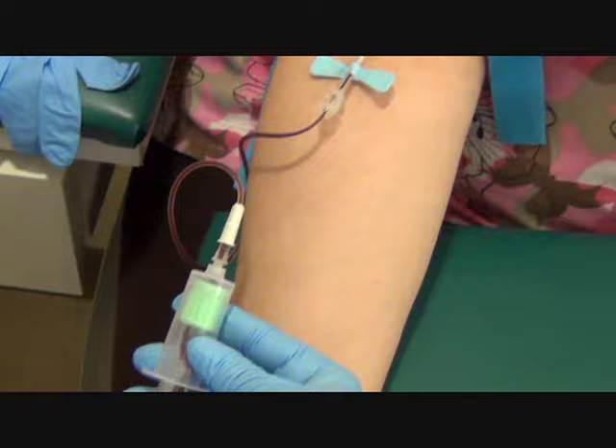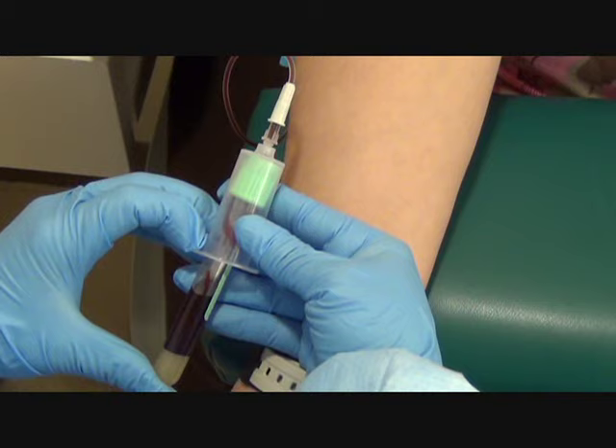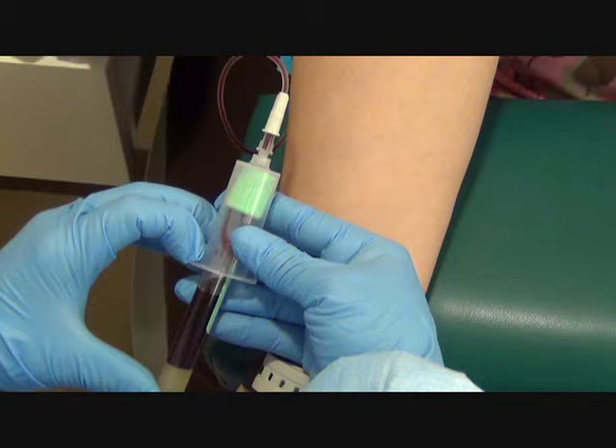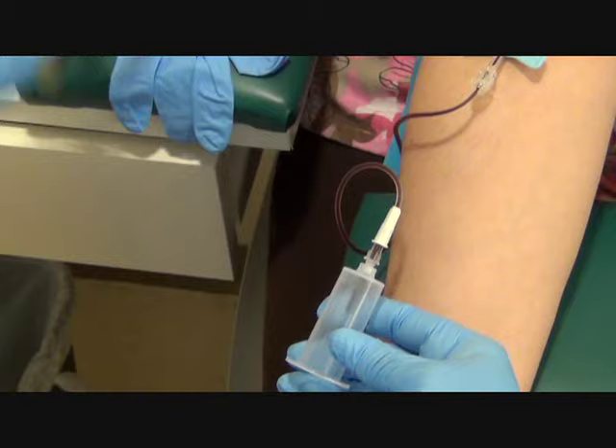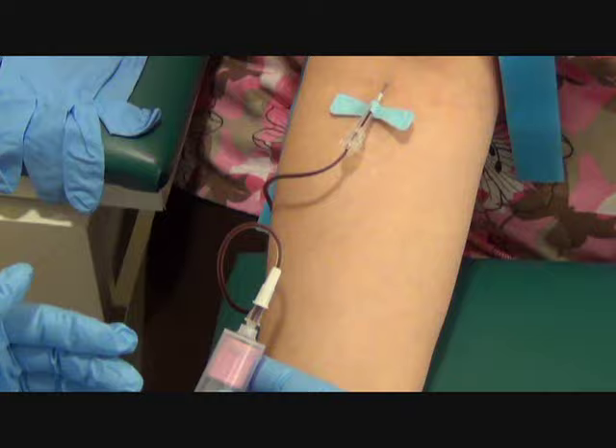Open your hand. The butterflies are smaller so the flow is going to be slower — I just have to be patient with it. Are you doing okay? Yeah. The entire time I'm drawing the blood, I want to make sure I'm aware of my tubing so I'm not pulling too far back, because if I pull too far back I can pull the needle out of the arm.